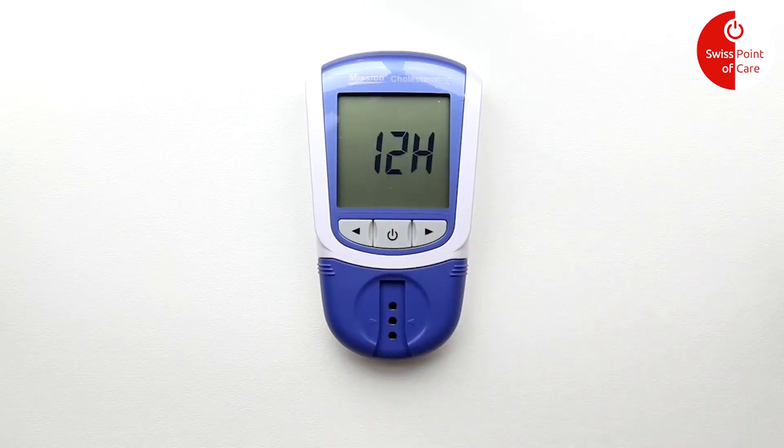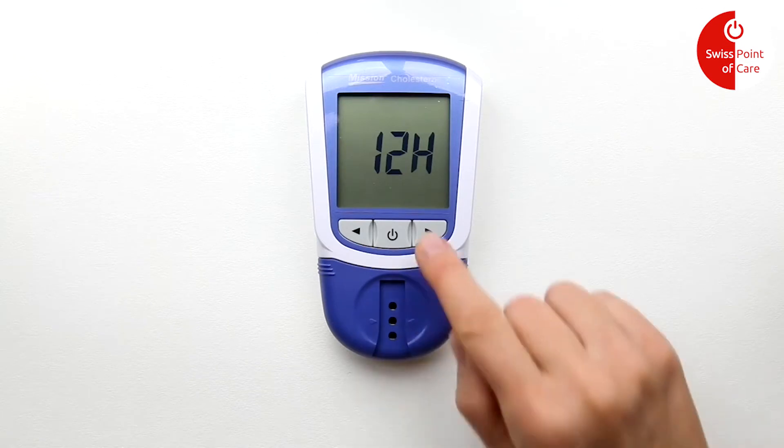You can now use the arrows to switch between a 12 and 24 hour time format. Press the power button to save.